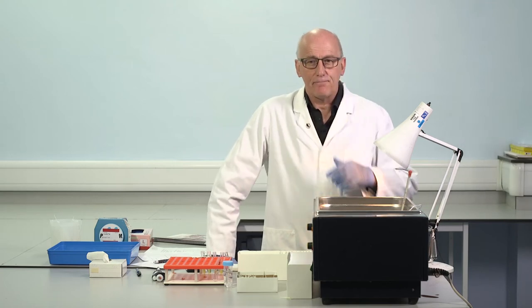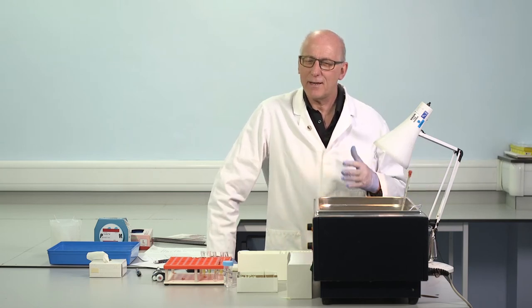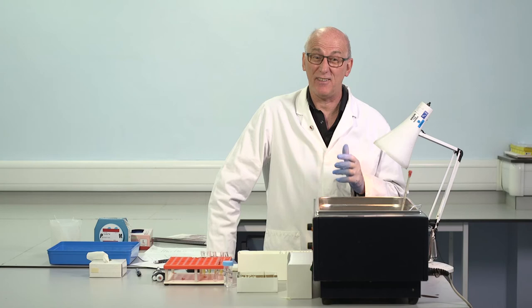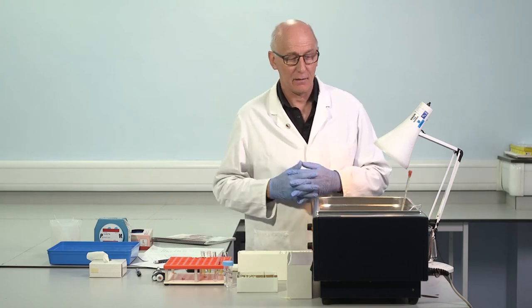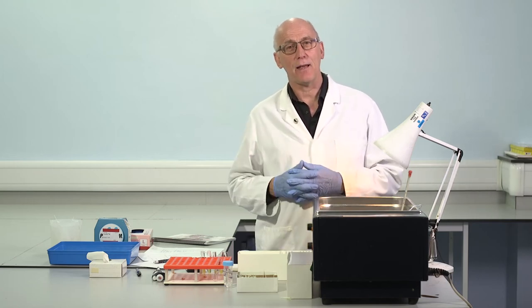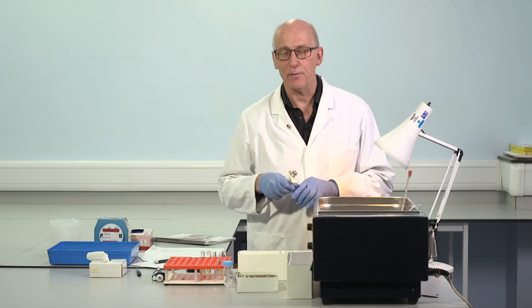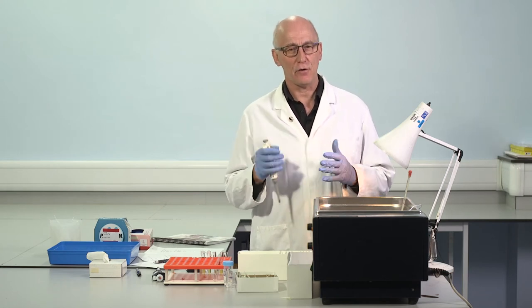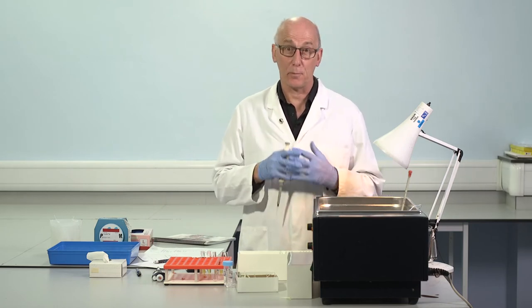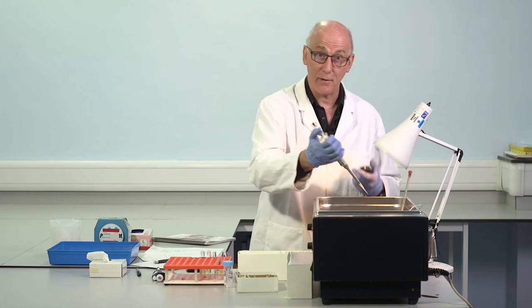The number of normal subjects that's needed. Well, we've got publications and guidelines, particularly from colleagues in clinical chemistry, that make a sound statistical defence for why, for full statistical validity, it's necessary to test 120 or more normal subjects. But we've also got useful guidelines in the WFH lab manual, also from CLSI, that remind us actually we can obtain a close approximation from even 20 to 25 healthy normal subjects when it comes to tests like PT and APTT. We can obtain a close approximation, sufficiently close for clinical purposes. So I think we do not need to test 120 for APTT, for example.